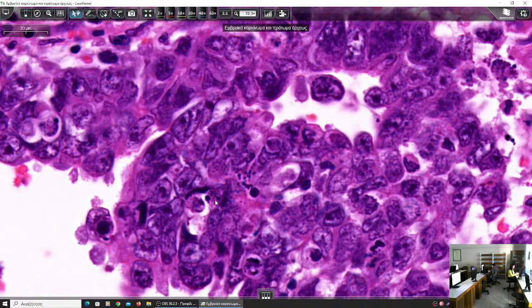Excellent. It is apoptosis. So if you give a drug that induces apoptosis and the tumor already has increased apoptotic potential, the tumor cells kill themselves. They commit suicide, some sort. So this is the embryonic carcinoma.